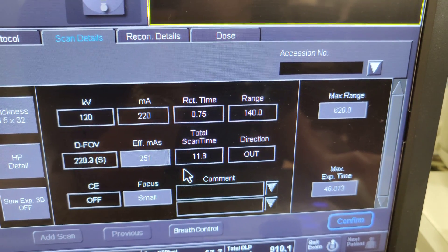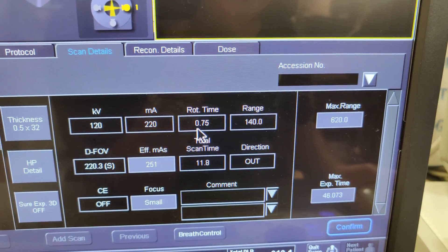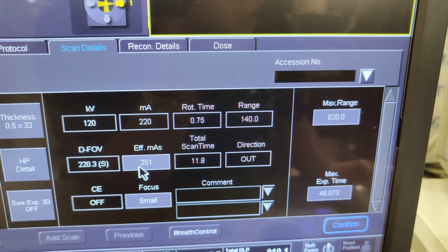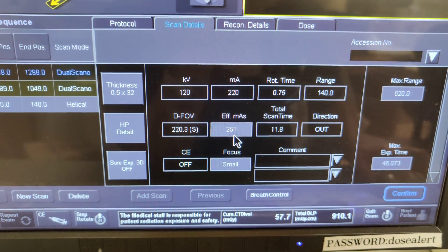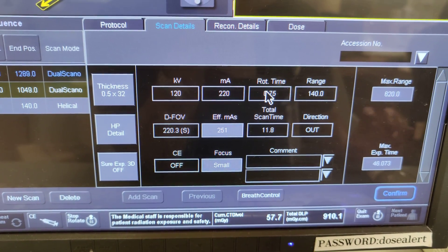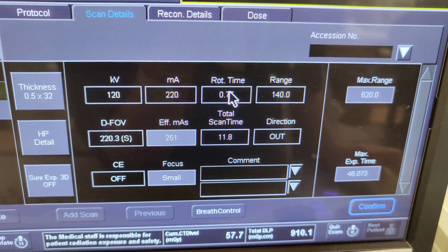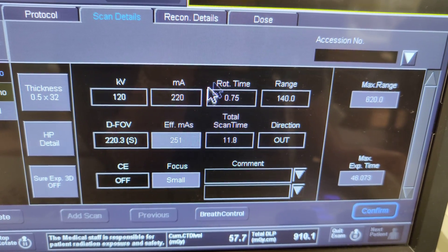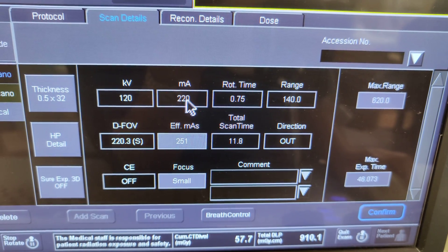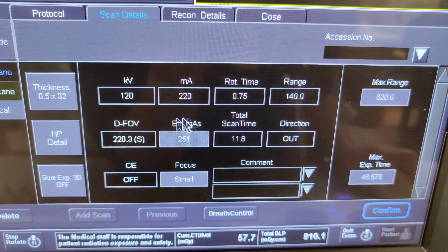We're targeting this effective mAs number. Let's say the patient is moving — the patient is agitated — and you want to go a little bit faster. You want to change these numbers so that the effective mAs will stay around this target. The target number is always the effective mAs. Our rotation time and the MA are what we need to consider changing, and we need to keep this number in the same ballpark.